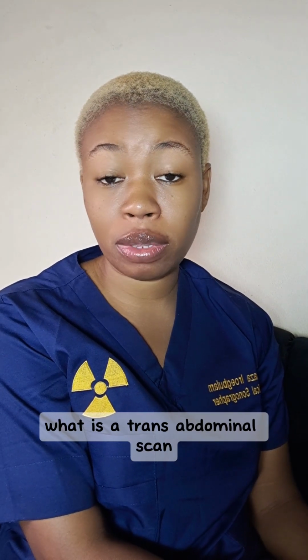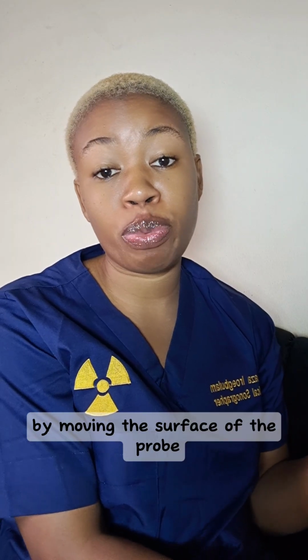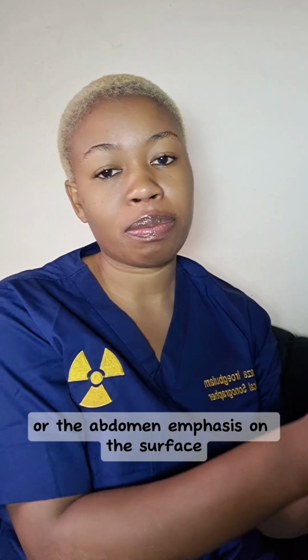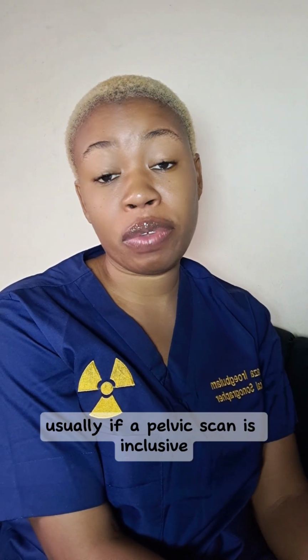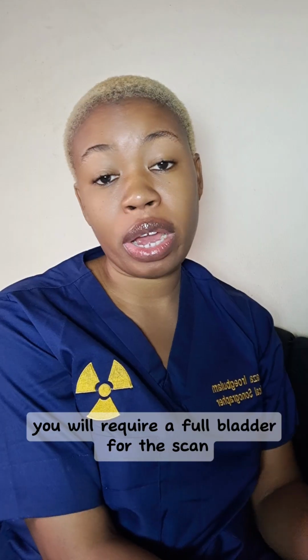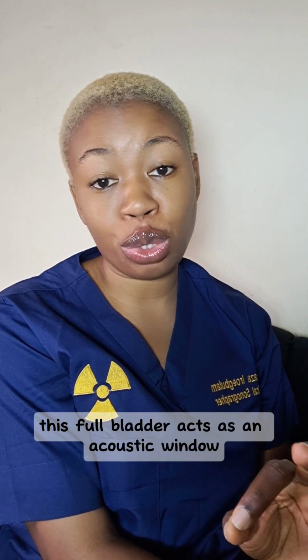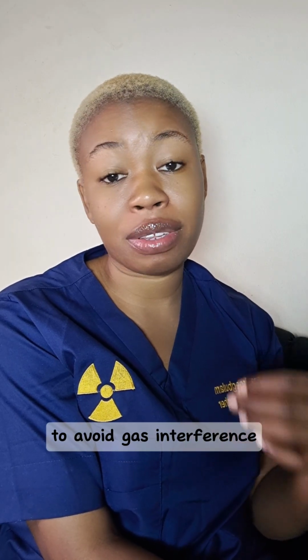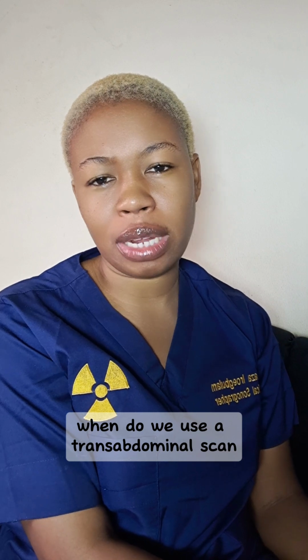What is a transabdominal scan? A transabdominal scan is performed by moving the probe on the surface of your skin or the abdomen, with emphasis on the surface, after the gel is applied. Usually, if a pelvic scan is included, you will require a full bladder for the scan. This full bladder acts as an acoustic window to move bowel loops out of the way, to avoid gas interference and enhance better visualization.